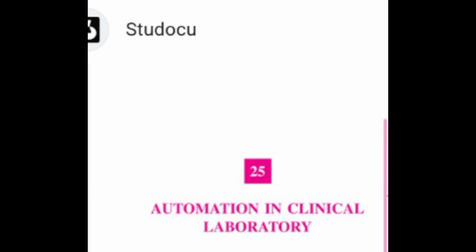Barcoding: a major advantage of automation of specimen identification is that barcoding technology has been introduced into several of the analytical systems that are now available in clinical laboratories. With this technology, a barcode label is placed onto the specimen container and is subsequently read by one or more barcode readers that have been placed at key positions in the analytical train. The resultant identification and other information are then transferred to and processed by the system software.